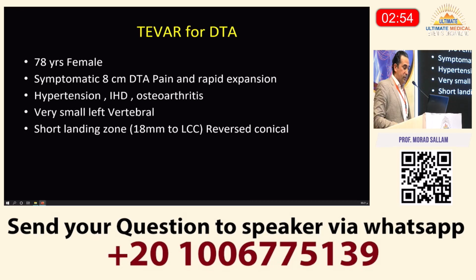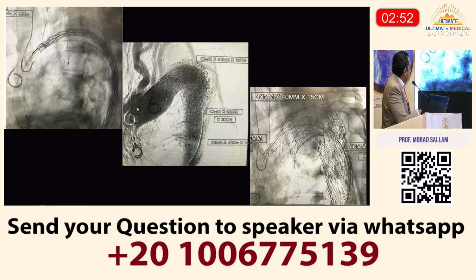it was a bit of a difficulty. What I want to highlight here is the difficulty was the right projection to separate innominate, carotid and subclavian to see the landing zone without having parallax in the graft. So we ended up putting a Gore graft, which slipped a little bit on deployment. And I think part of it, we were a little bit distal, and the other part was just because of the deployment. We didn't take all of the tension.